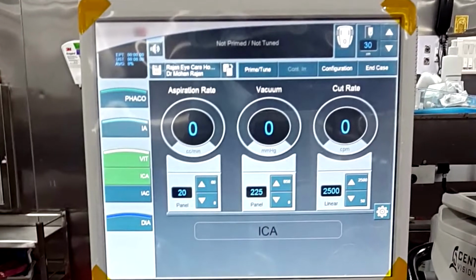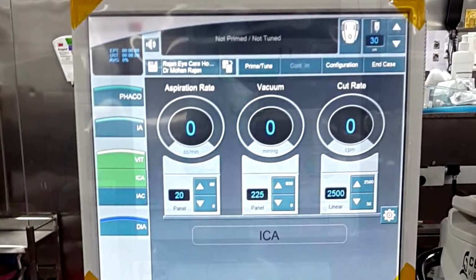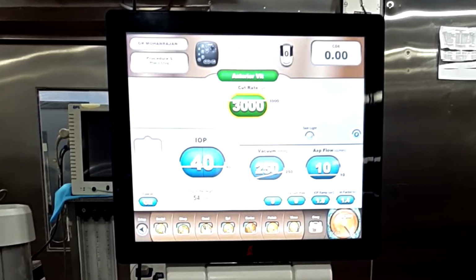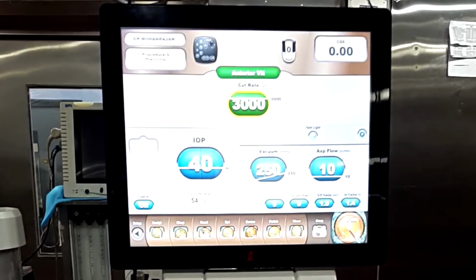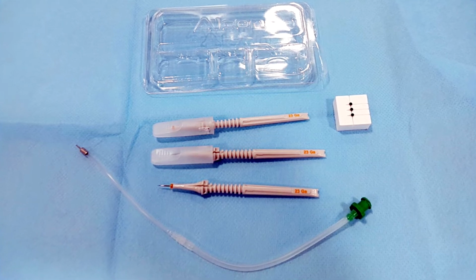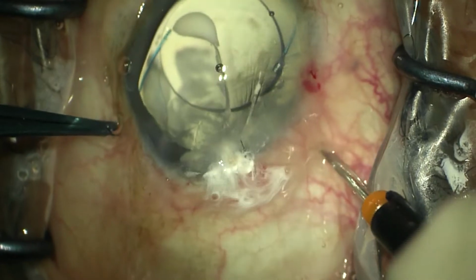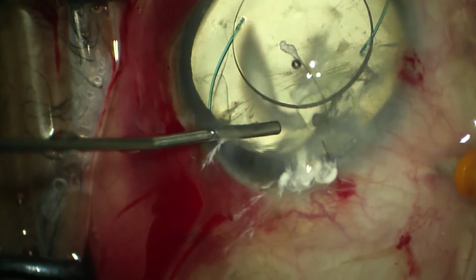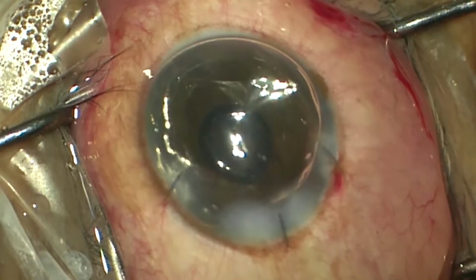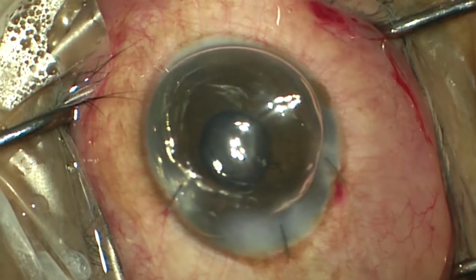All the phaco machines are providing posterior vitrectomy cutters, which are either 23 gauge or 25 gauge, which enables us to do the vitrectomy through the pars plana sutureless. The trocar and cannula system can be a little tricky. The trocar and cannula system has to be introduced through the pars plana, which is about 3.5 millimeters posterior to the limbus.